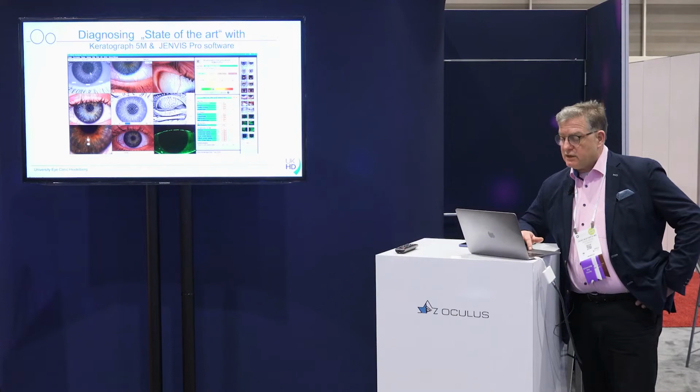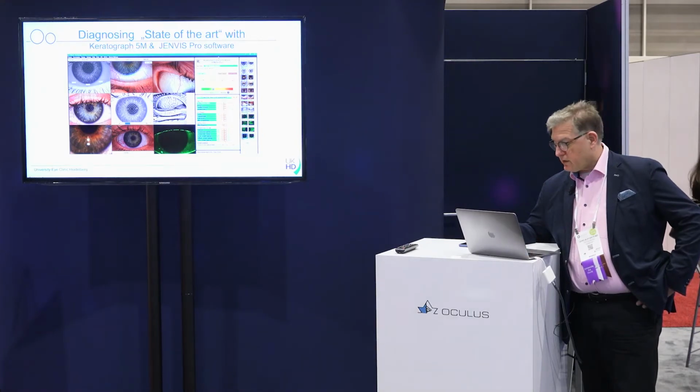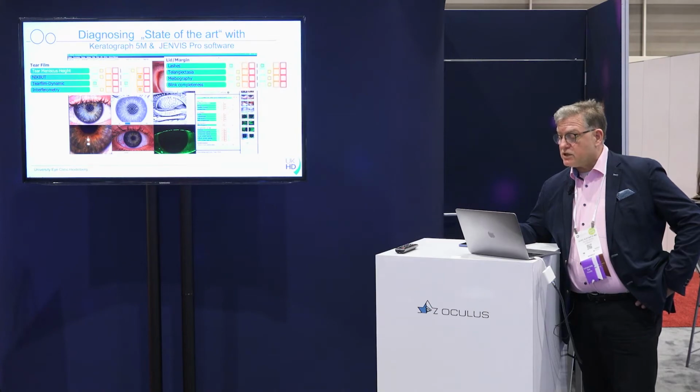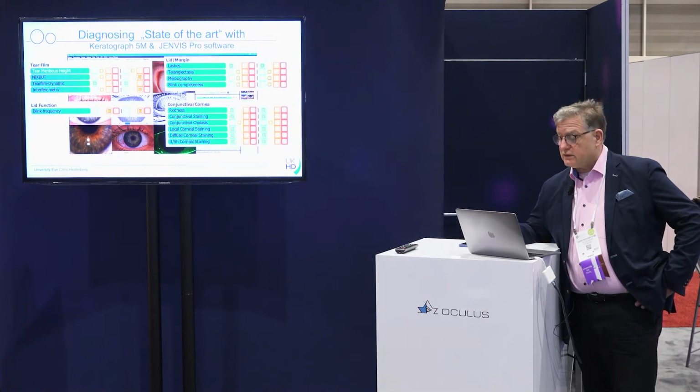For example, these 9 images, pictures here, where all the measurements are visualized, but you also get that in terms of tables and a kind of report that is given to you. So the tear film, the lid margin area, the lid function, also the blink frequency, conjunctiva, cornea, redness, and so on.